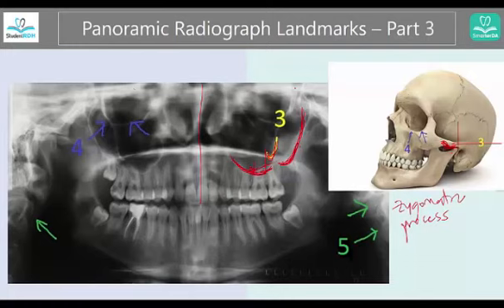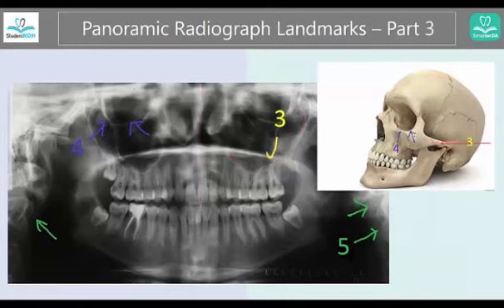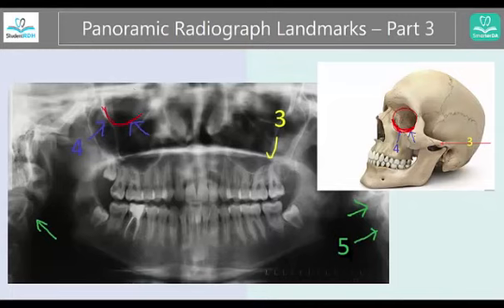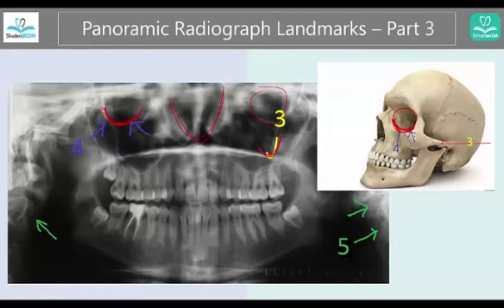Let's jump to number four. Number four is this area — try to highlight this whole entire area. This is the bottom of the orbit. You can see your eyeball would be here and the bottom is formed by many different bones. There's no other structure that looks like just a U or round that is so high up. So you can imagine the eyes over here, the nose over here, and your cheekbone — the zygomatic process — over here.